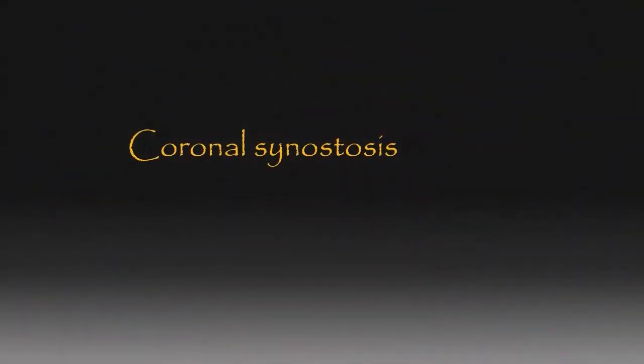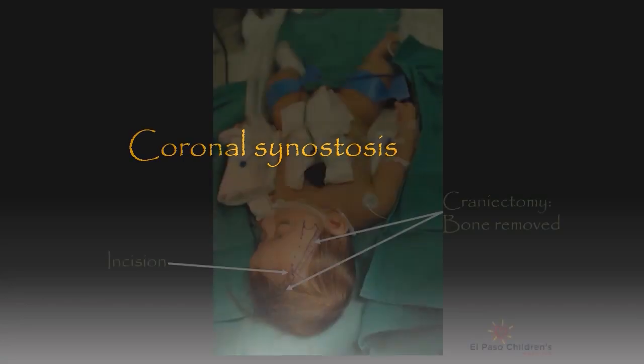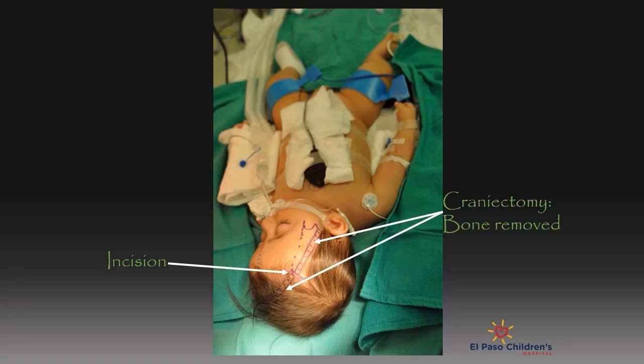Craniosynostosis presents with a number of complex deformities which are very difficult to treat once the patient reaches a year of age or more. These deformities include vertical dystopia, nasal deviation, strabismus, and cranioscoliosis. Our approach is to simply create a new suture as seen on this intraoperative photograph. It must extend from the anterior fontanelle all the way down to the squamosal suture behind the pterion. We also perform the entire procedure through a single 2 cm incision located as shown on this photograph.